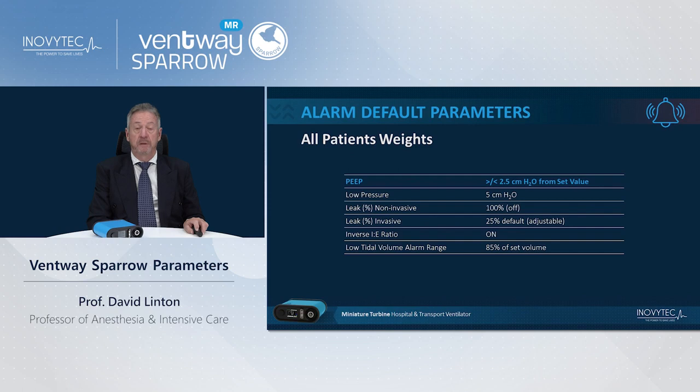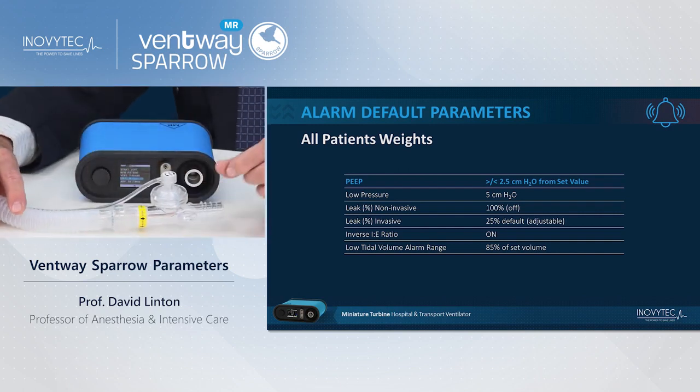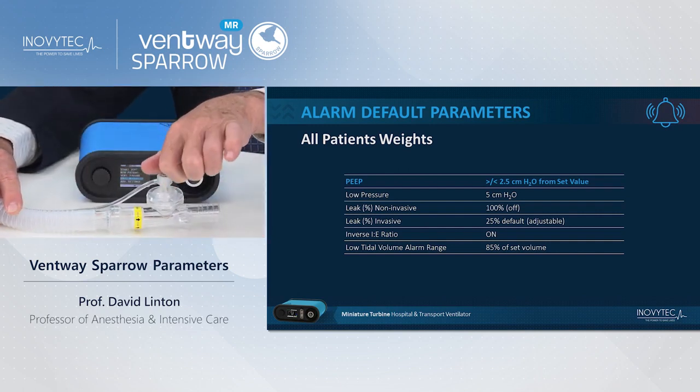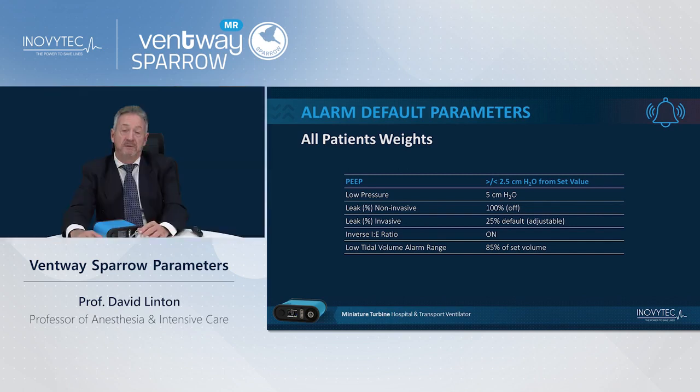And how to set the alarm, the PEEP on this ventilator is on the circuit. There is a PEEP valve adjust, and you adjust the PEEP, and at the bottom of the screen during the ventilatory parameters you see the PEEP level that you've selected. It's of great interest to me that there's a big difference between the set PEEP and delivered PEEP on every ventilator.